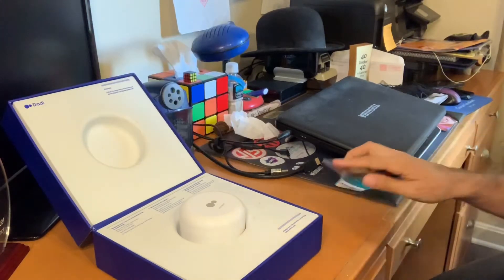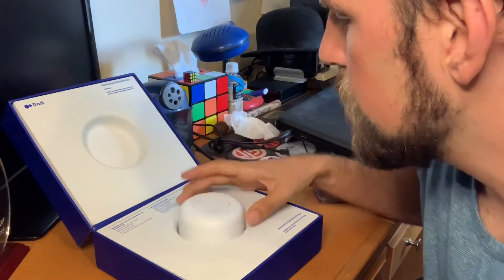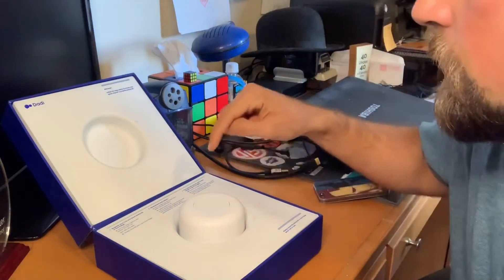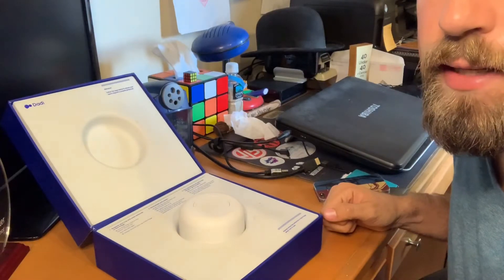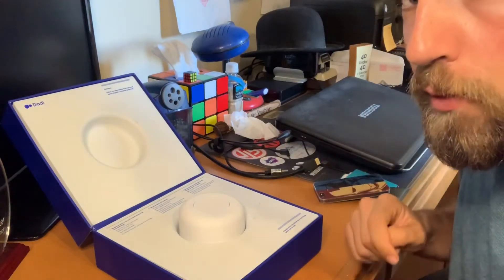That registration was extremely fast. The next step is going to be collecting the sample, avoiding lubricants, tightly screwing on the lid, and then pressing the button on the lid. Once this has been sitting for about 20 minutes and come to the right temperature, we'll get to work.